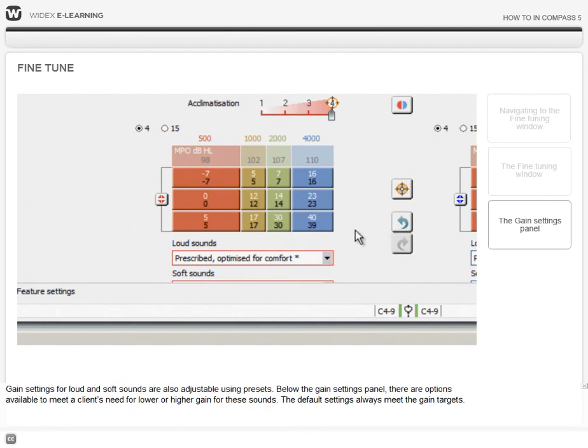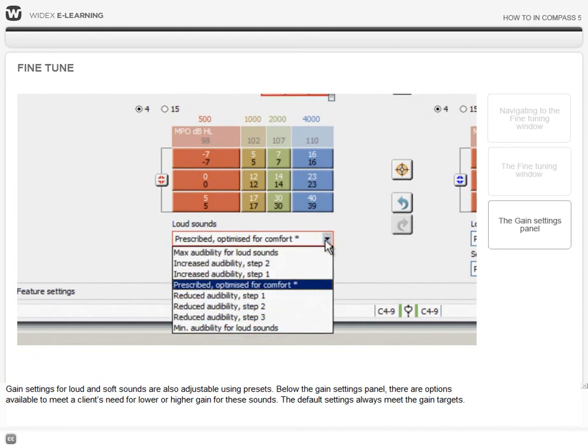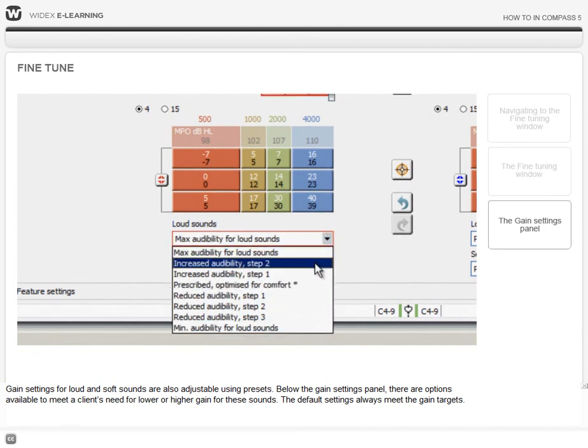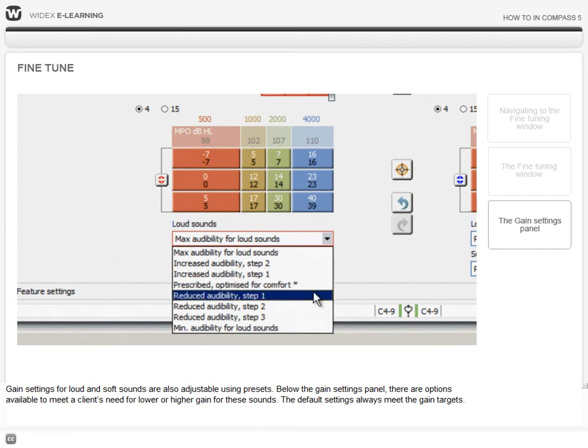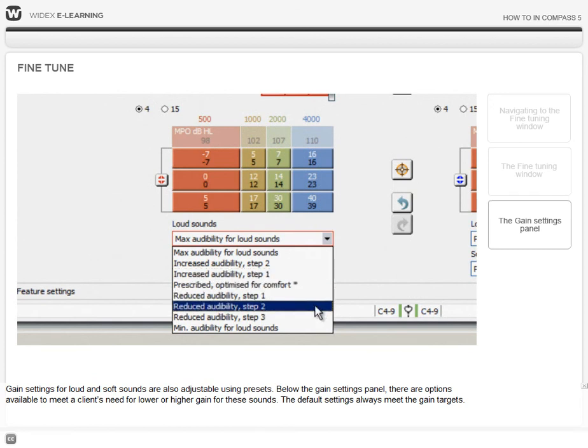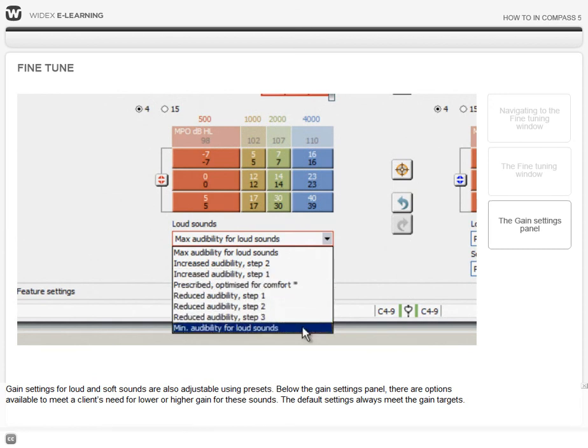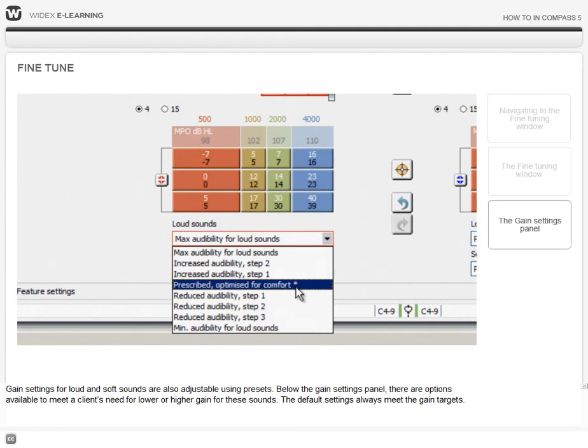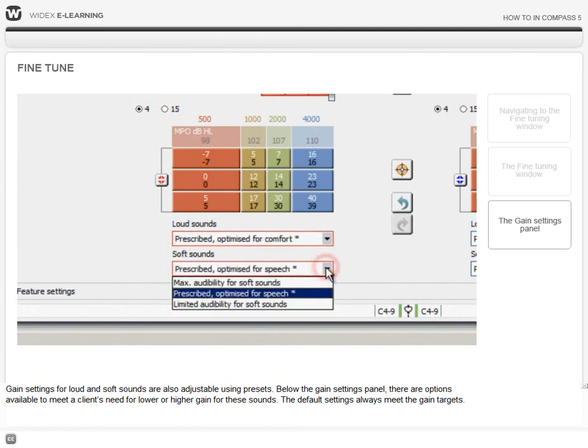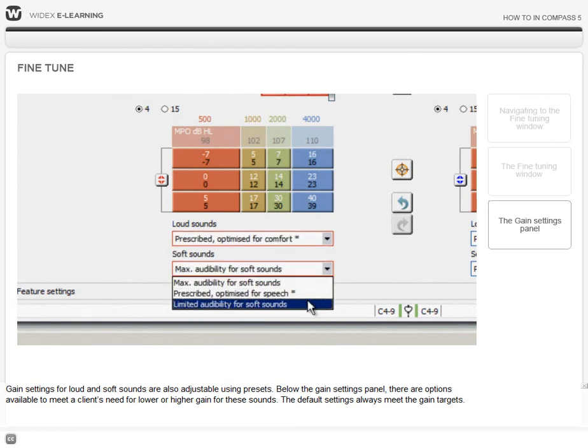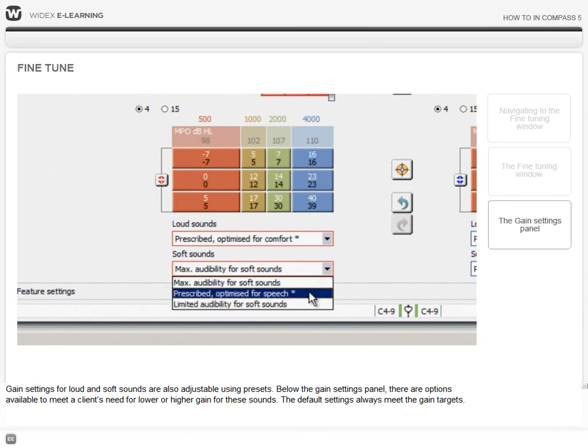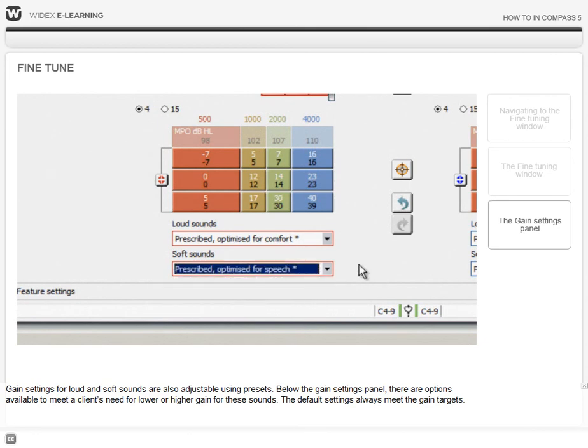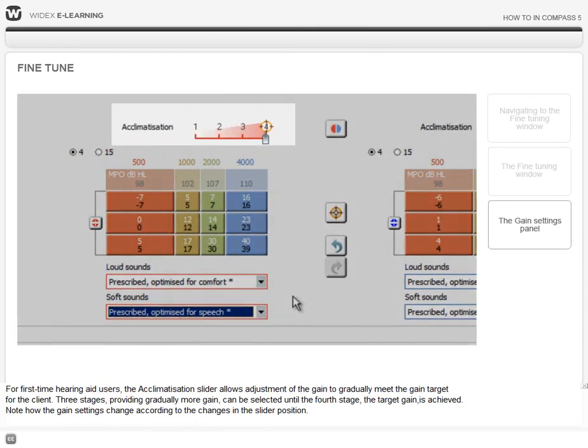Gain settings for loud and soft sounds are also adjustable using presets. Below the Gain settings panel, there are options available to meet the client's need for lower or higher gain for these sounds. The default settings always meet the gain targets.